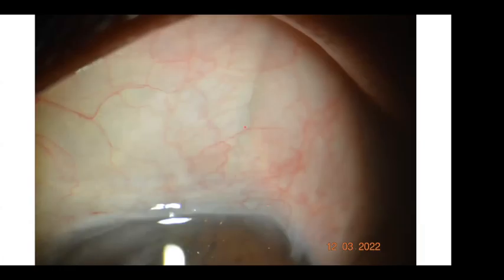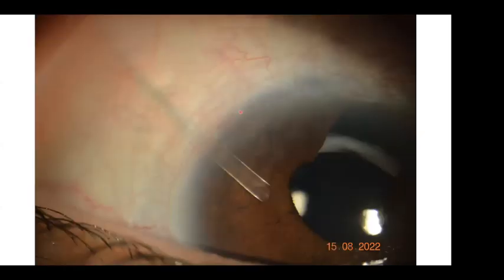This is the appearance of the tube like 1 year after the operation, so the tube is not very well seen. But sometimes a shadow of the tube is seen. And this operation was like 1.5 years ago, I really don't know. But this could be further improved if you dissect the sclera deeper, so that with experience you can handle the sclera to have the tunnels deep and you have the flap deep as well.